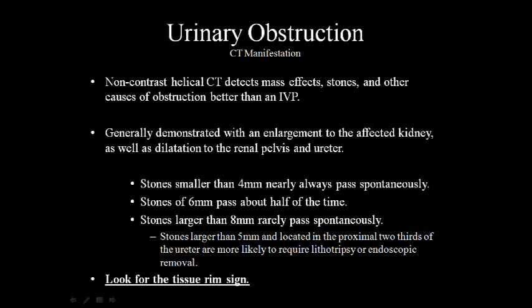So typically we're looking for a non-contrast helical CT to detect mass effects, stones, and other causes of obstruction, and it does it in a better way than an IVP. The reason that we favor CT is because, once again, not all obstructions are from stones. So keep that in mind, write that on your PowerPoint, that not all obstructions are stones. And keep that in mind, put that away for future reference, because even in your clinical setting, we see such a prevalence of stones that we think that everyone is having a stone.